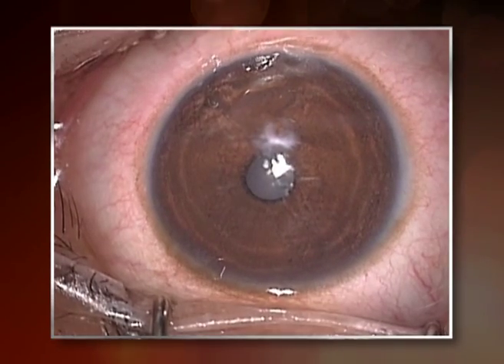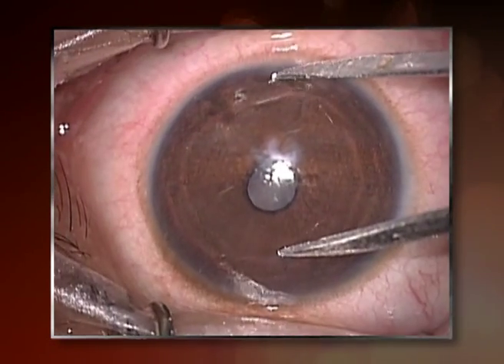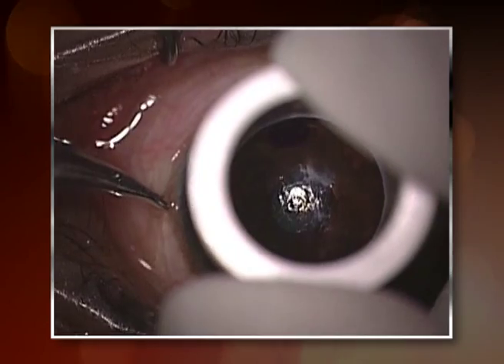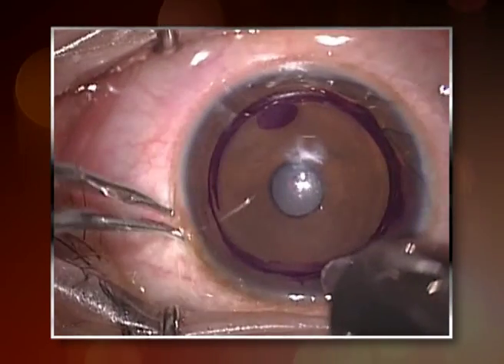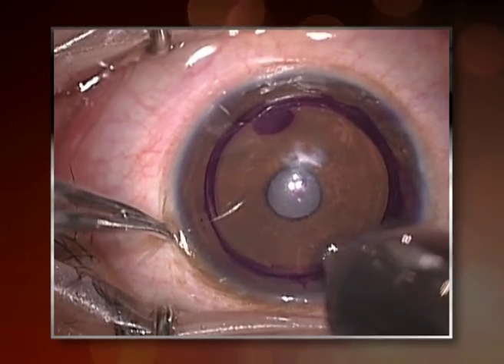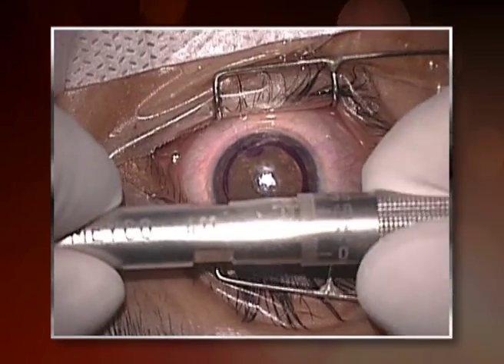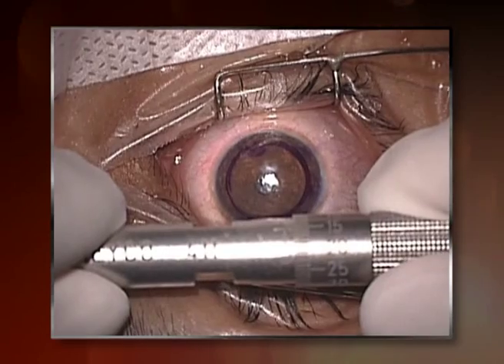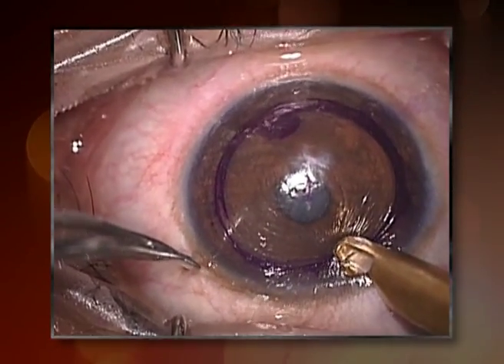The surgery is performed under peribulbar or general anesthesia. A circular mark 7.5 to 8 mm in diameter is made on the host cornea using a disposable trephine blade whose edges have been stained by gentian violet. Intraoperative ultrasonic pachymetry is done on this corneal mark between 11 and 1 o'clock. A diamond knife set at a depth of 30 microns less than that of this intraoperative pachymetry reading is used to make an incision of 2 to 4 mm at the 11 to 12 o'clock position.